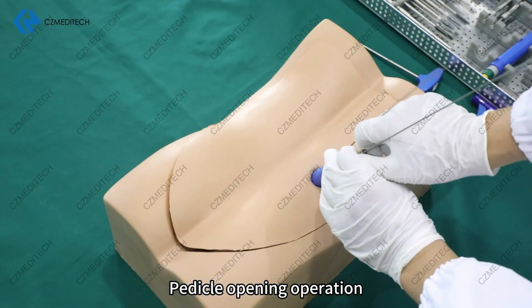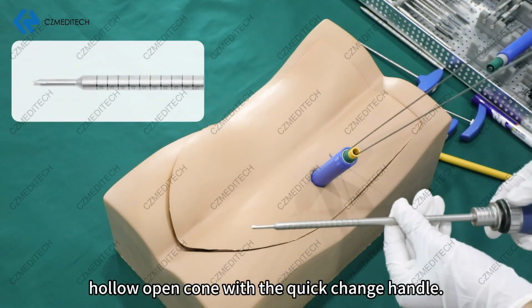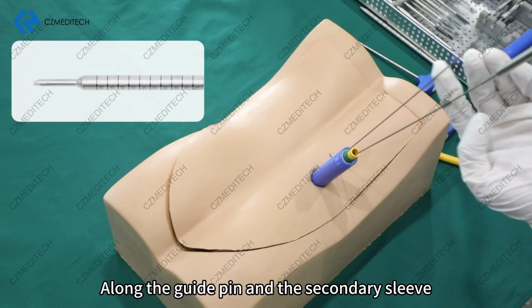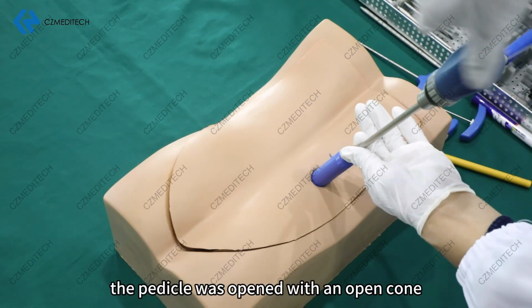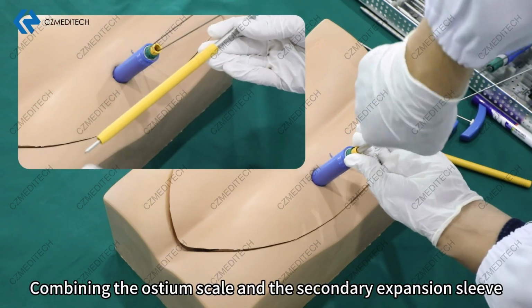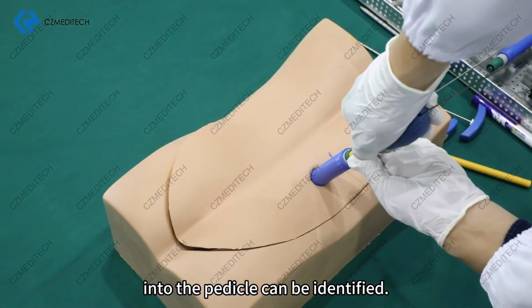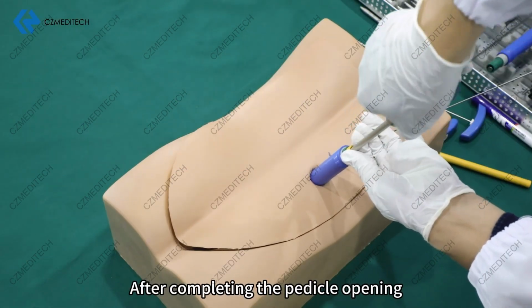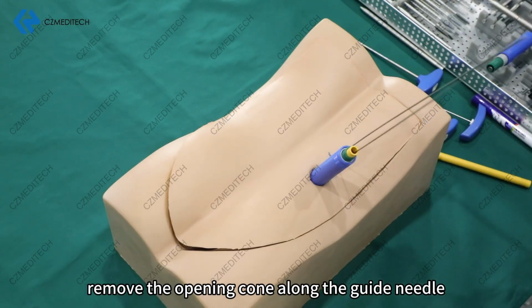Pedicle opening operation. Pull out the primary metal sleeve and match the hollow open cone with the quick change handle. Along the guide pin and the secondary sleeve, the pedicle was opened with an open cone. Combining the ostium scale and the secondary expansion sleeve, the insertion depth of the opening cone into the pedicle can be identified. After completing the pedicle opening, remove the opening cone along the guide needle.